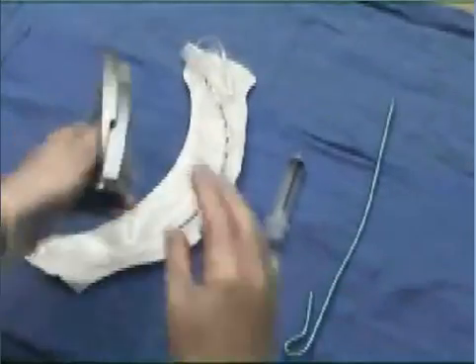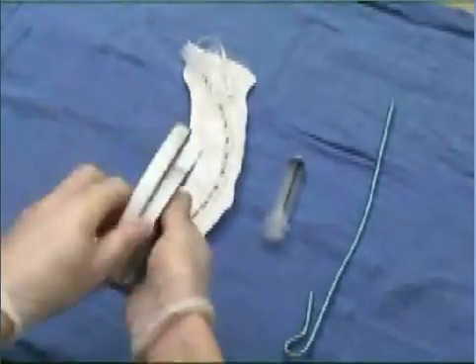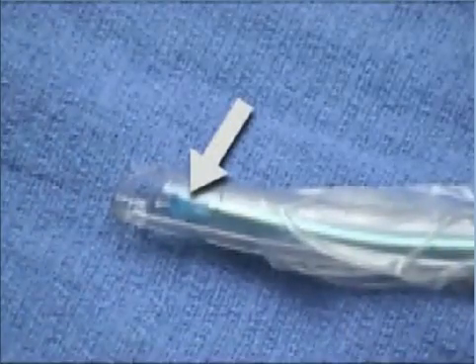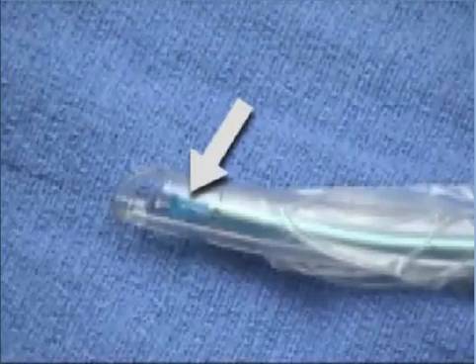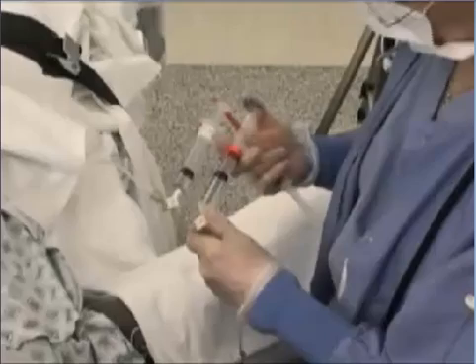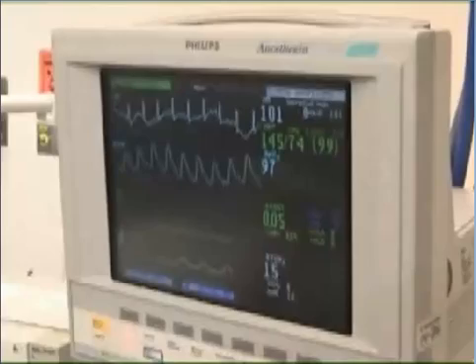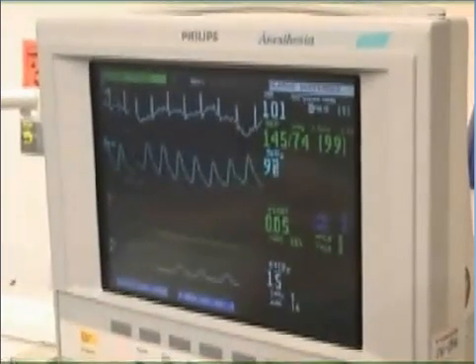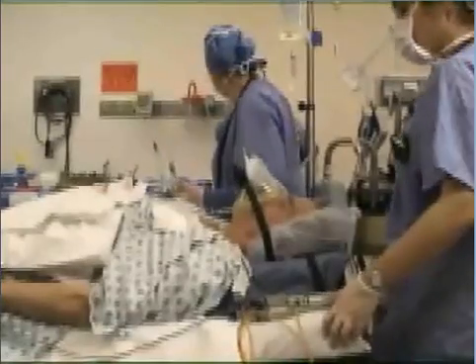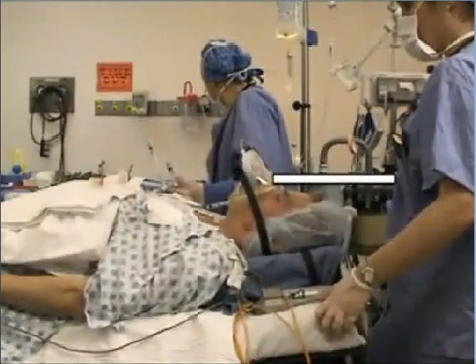Before proceeding, be sure that all equipment is readily accessible and functioning. Inflate the cuff of the endotracheal tube to check for leaks. Insert the stylet into the endotracheal tube, making sure that the tip of the stylet does not extend beyond the end of the endotracheal tube. Be sure that the suction catheter is secured within easy reach. Obtain intravenous access and place the patient on a monitor if time and conditions permit. Assign an assistant to watch the monitor during the procedure and report any changes.